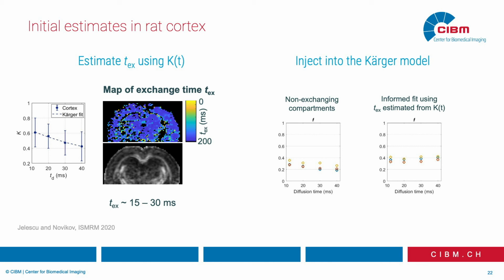Yes, so there is a group in Freiburg who uses such a Bayesian framework. For us, once we have this a priori knowledge of roughly in which corner of the fitting landscape we should expect a solution, very concretely that we now impose that the intra-axonal diffusivity should be faster than the extra-axonal, then you can choose your fit initialization in that area. And this actually suffices to typically find the same solution reproducibly. But you can definitely use a Bayesian framework, yes.